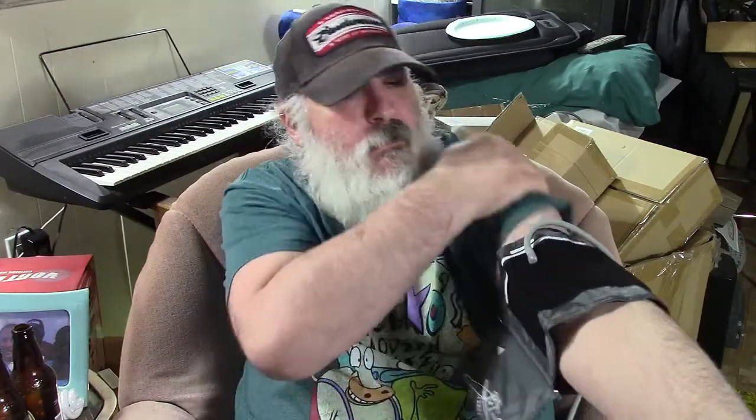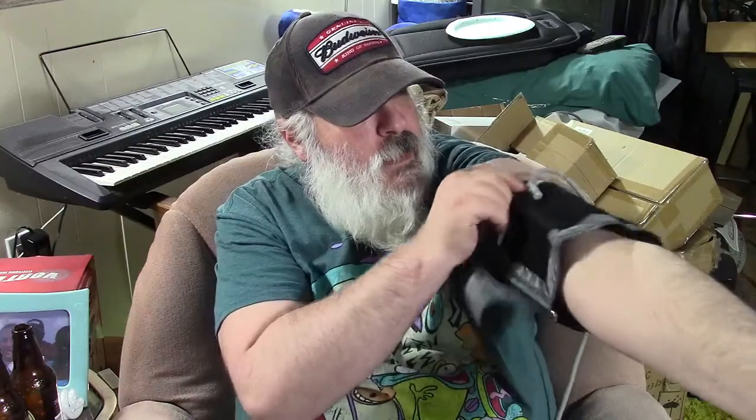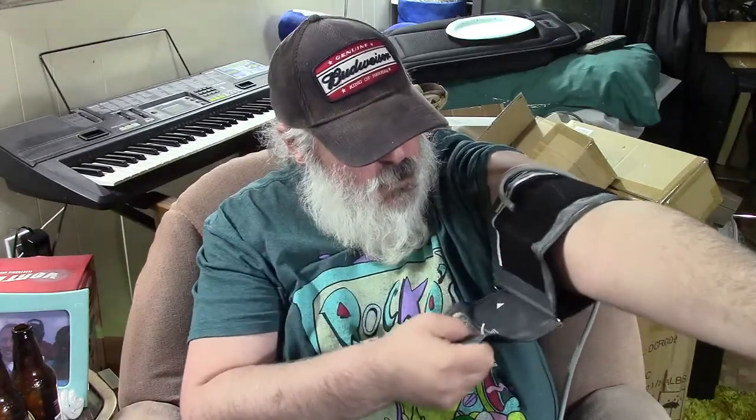I'll demonstrate that now. Open the cuff up, pick up your shirt sleeve, and place it about an inch or so from your elbow. Pull it and bring it around — it's easier if you have somebody else to help, but you get the idea. Sit with your palm up and you want the hose to be roughly in line with your index finger. Then take the machine and simply plug it in — it just pushes in like that.